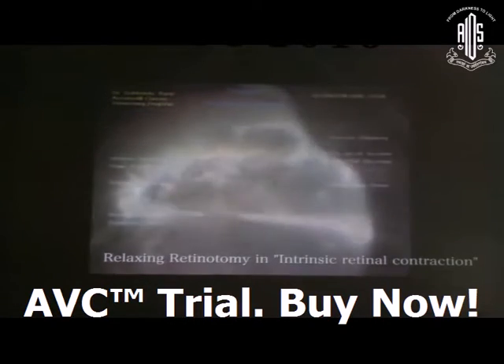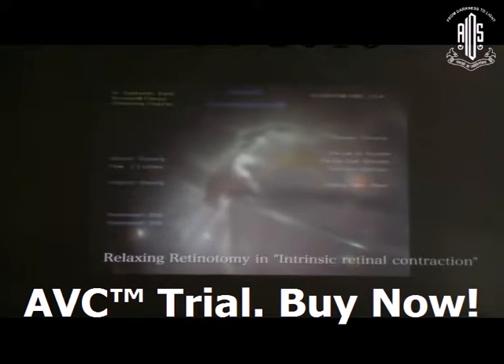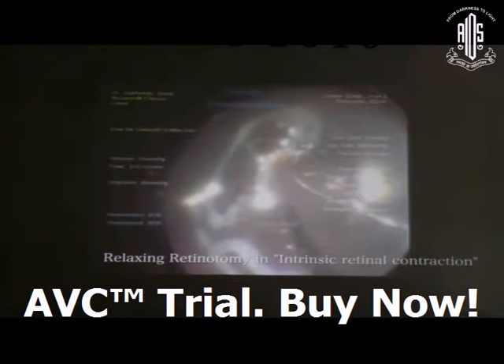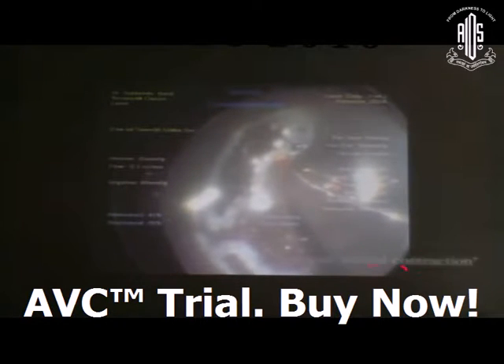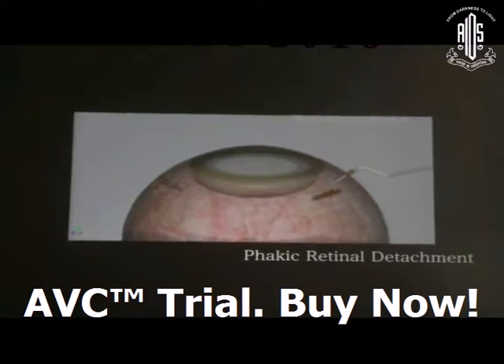When you are doing fluid exchange and encounter intrinsic retinal contraction, turn the infusion on again and perform a liberal relaxing retinotomy to release all the fixed folds and residual intrinsic contraction. Then do fluid exchange and laser. Now coming to the phakic retinal detachment — they are a very tricky situation.